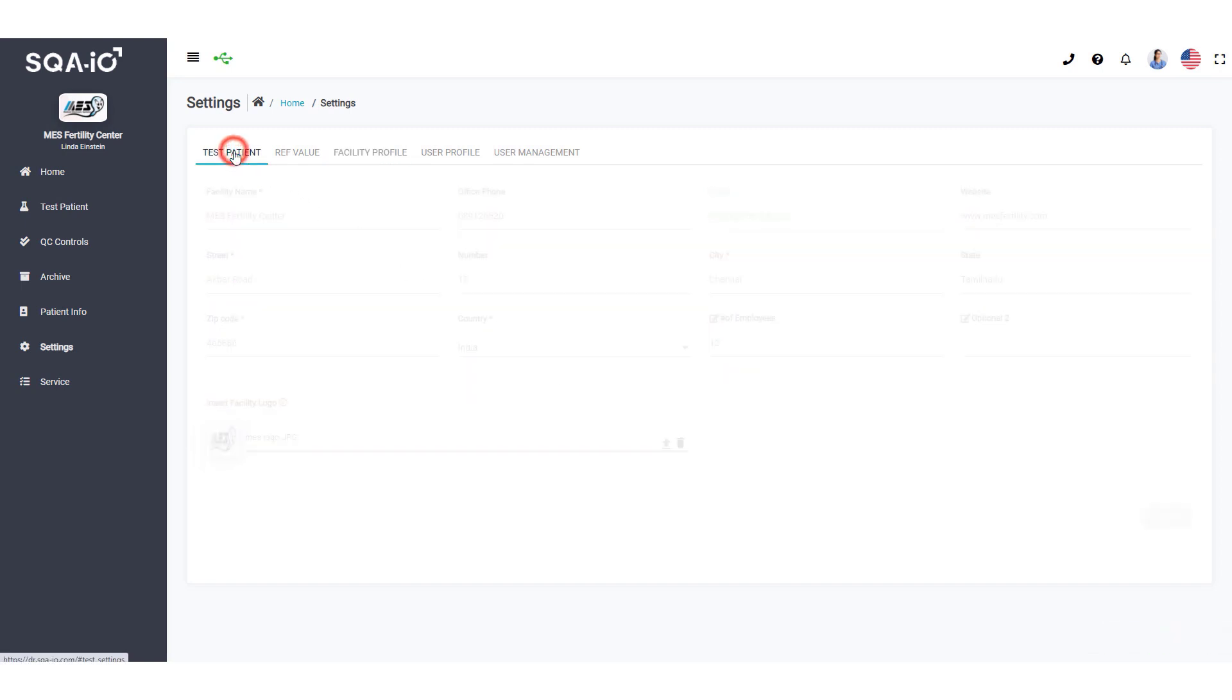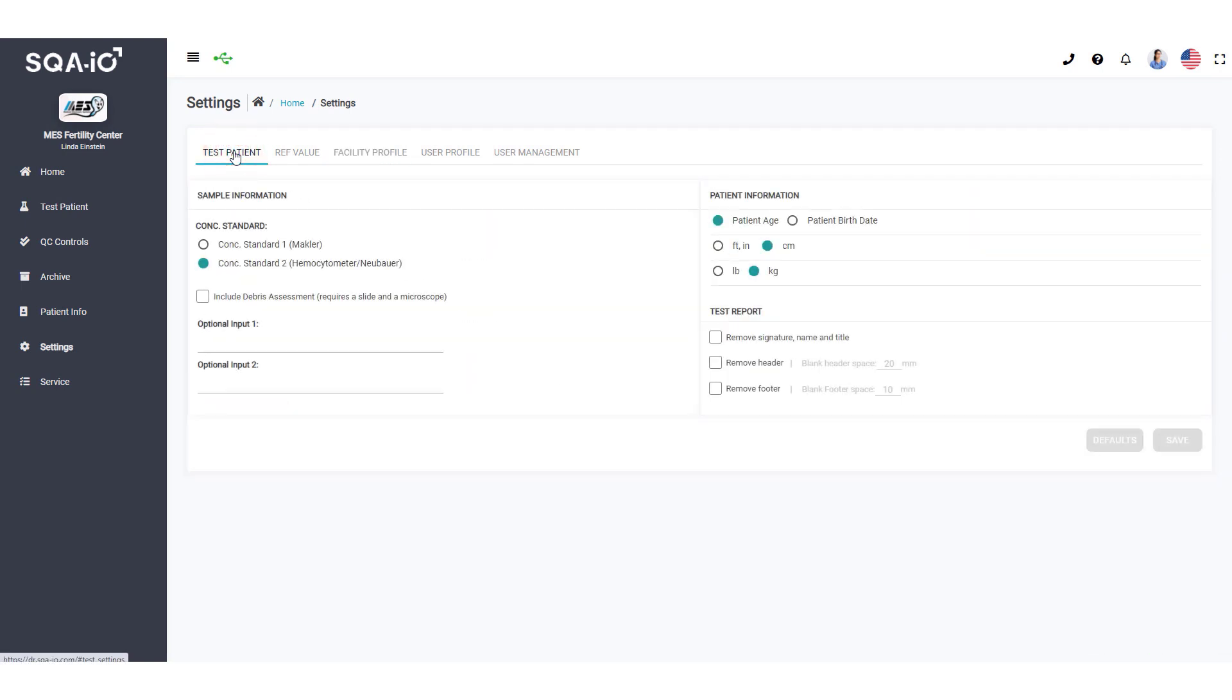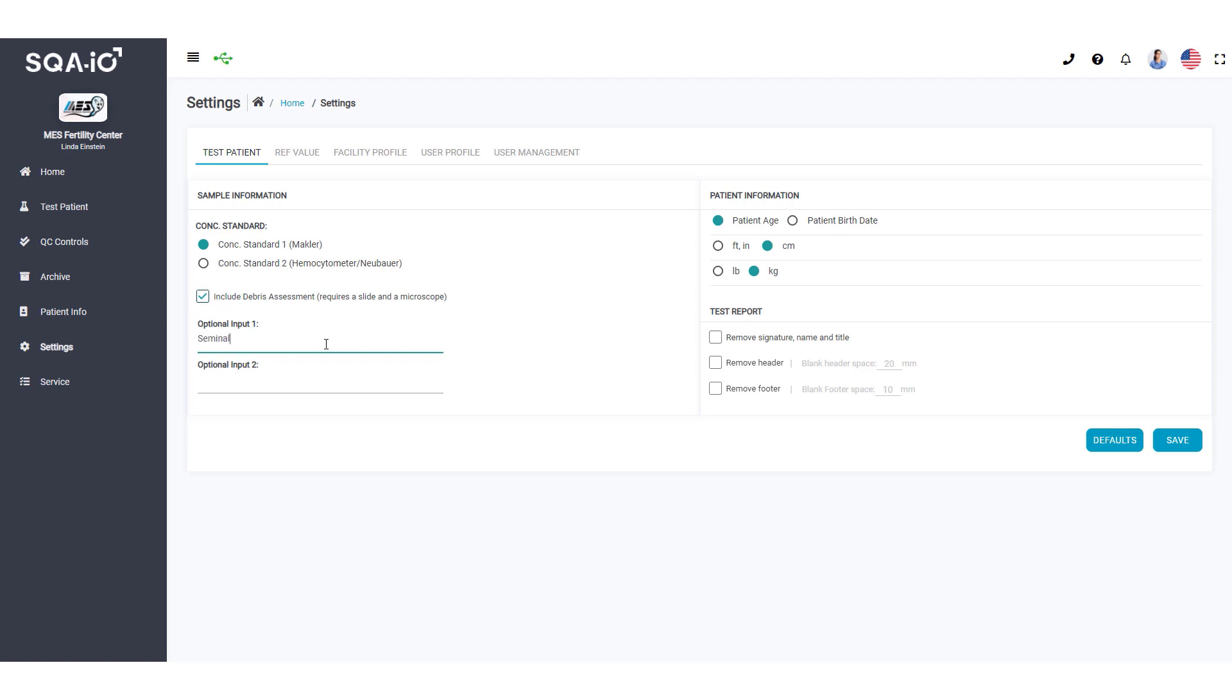Click Test Patient to select the default settings for semen testing in your lab. Assign titles to the optional fields. The titles will appear on the Test Patient screen and Test Report. Select how to report patient information and check the boxes to format the test report.